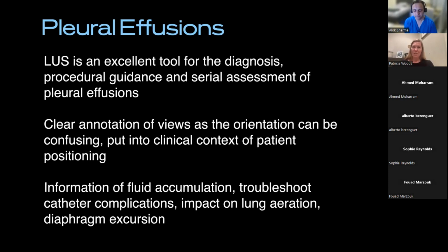But serial assessment can help you, I think, when it comes to effusions, like in neonates, non-hydrops, when you're caring for them for weeks and weeks and weeks, transitioning your care, whether it's Monogen or octreotide, whatever you started. So that serial assessment of fluid production and absorption is interesting. But I don't have a good recipe for you for volume calculations. I don't know if anyone else online has. I'm not sure. Thank you very much.